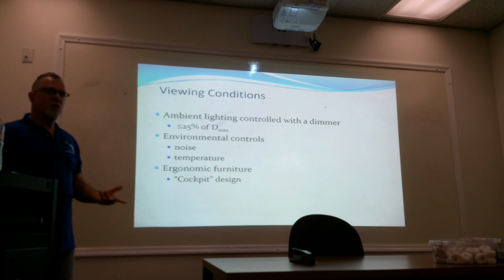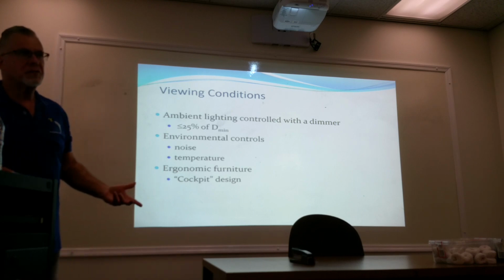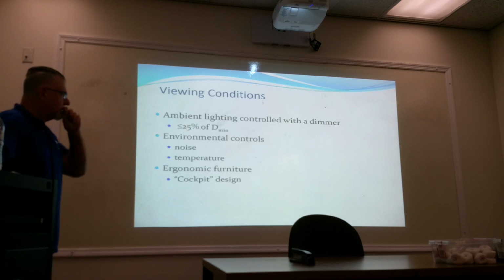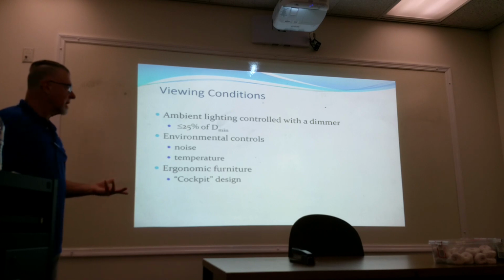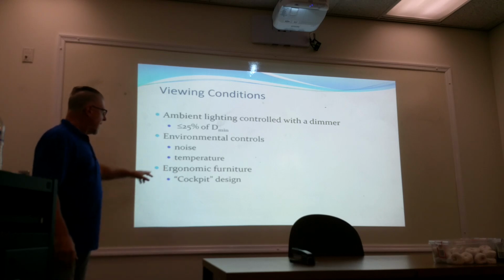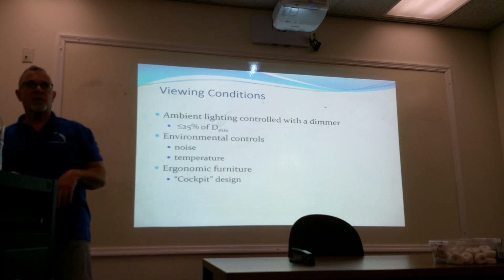Environmental controls: noise and temperature. Radiologists are sitting at these things for a lot of hours during the day. You want to keep noise down. You want to keep it at a reasonable temperature. And you want ergonomic furniture.